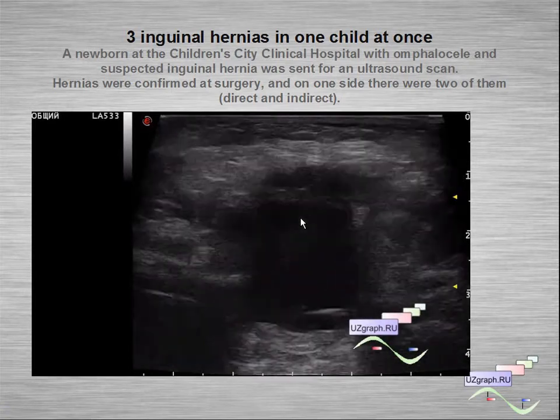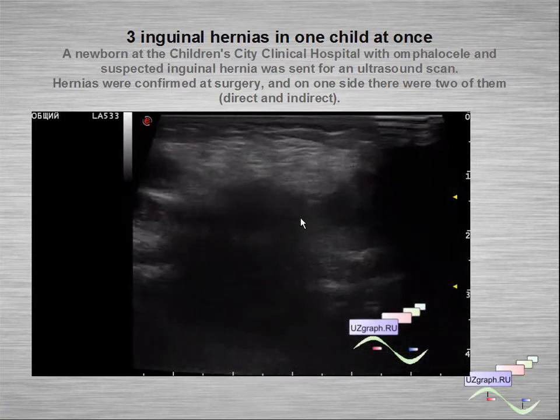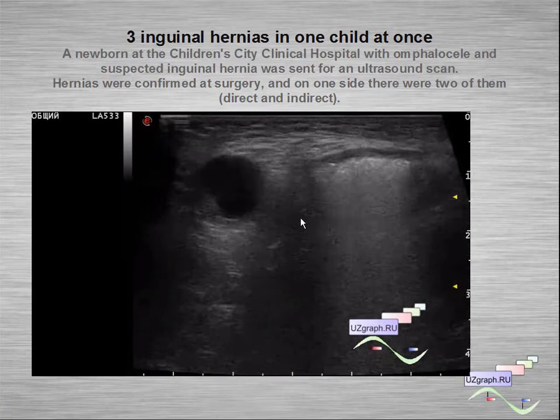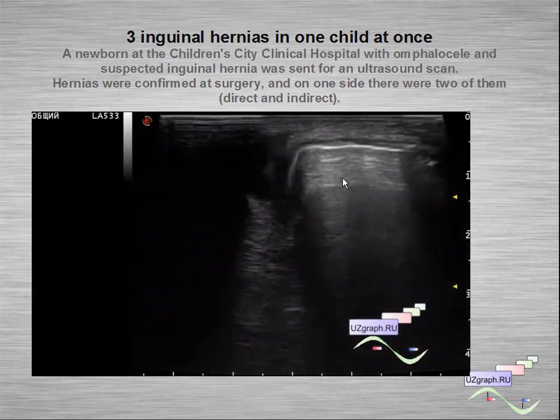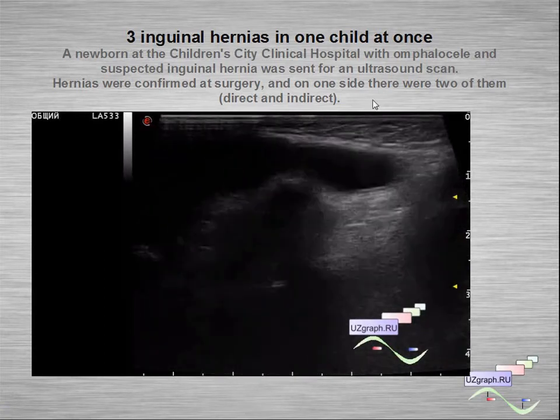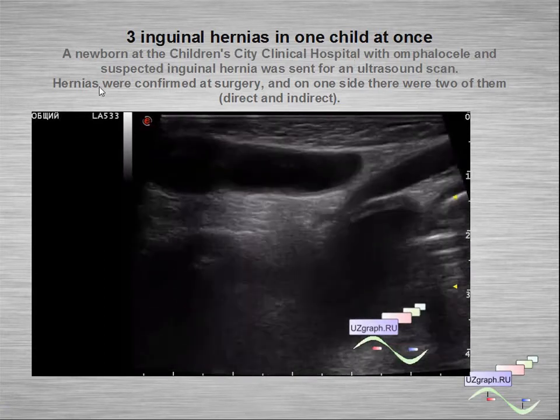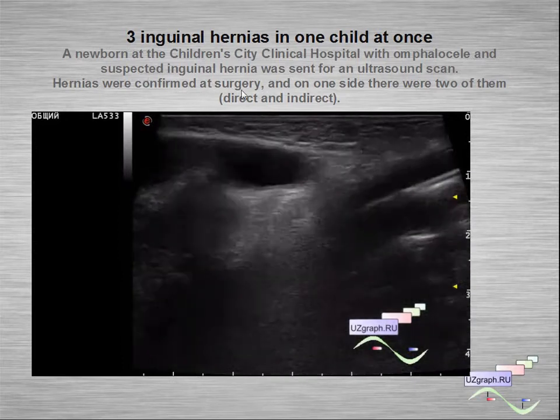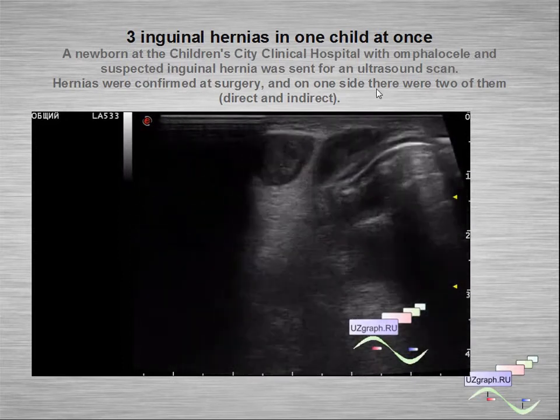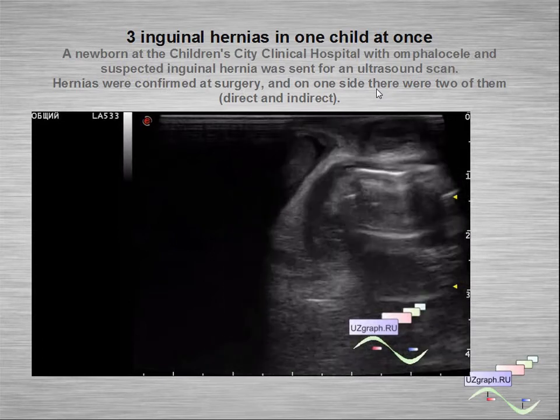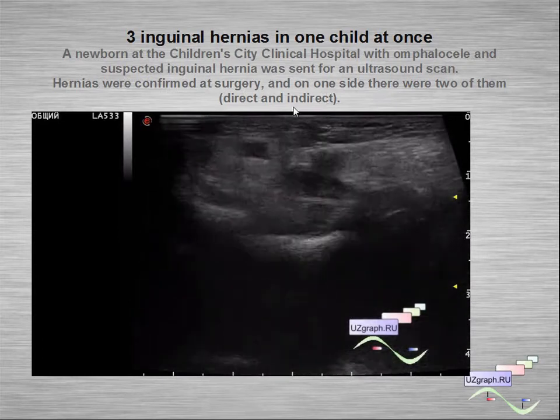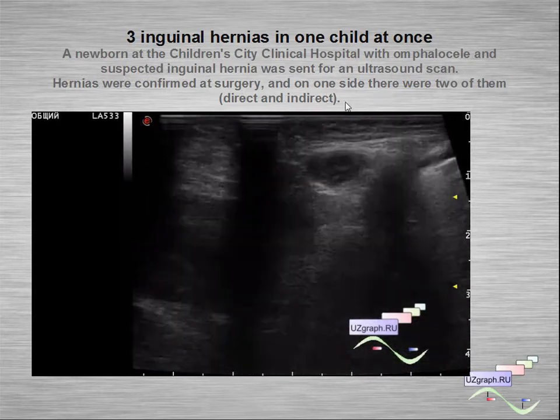A case of three inguinal hernias in the same child — we can see them: one, two, three — which was confirmed at surgery; on one side there were two of them, one direct and one indirect.